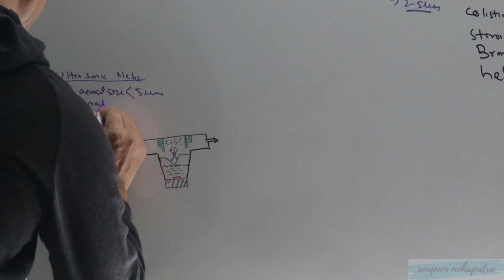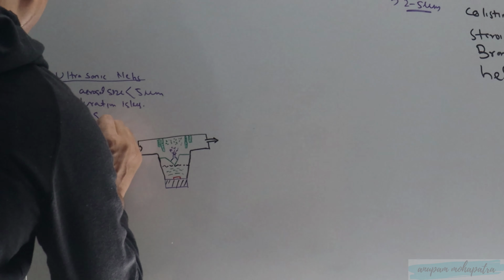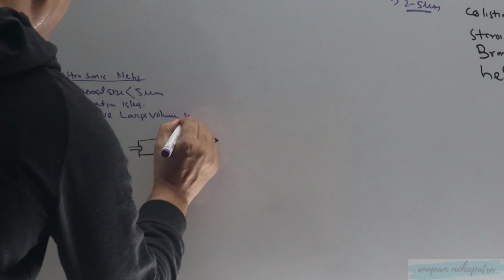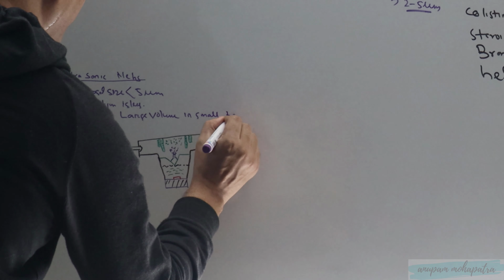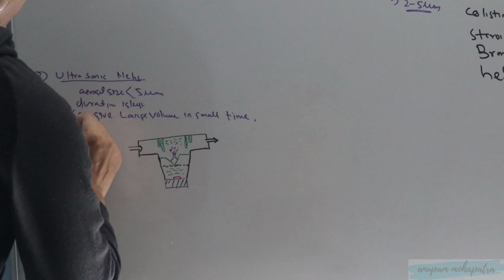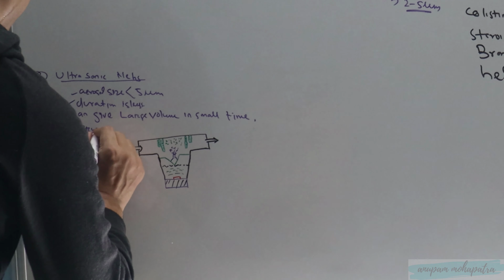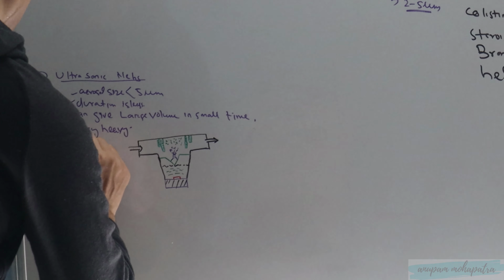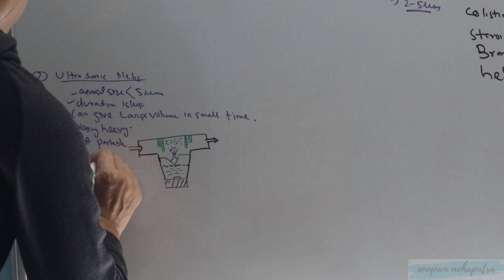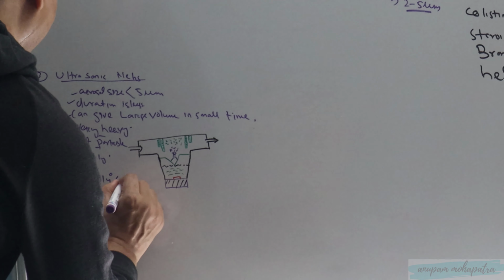Duration is less, so it can give large volumes in small time. Disadvantage is very heavy, not portable, costly, and it produces a temperature of 10 to 14 degrees centigrade higher.